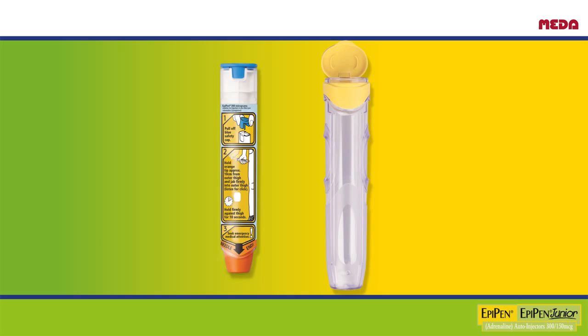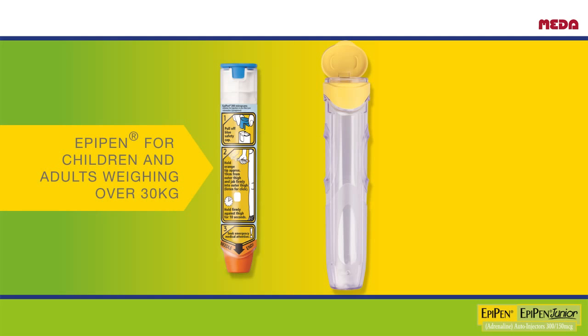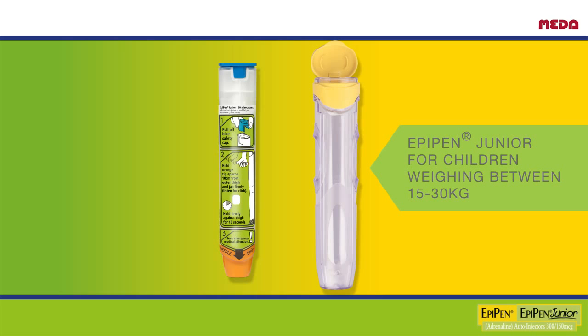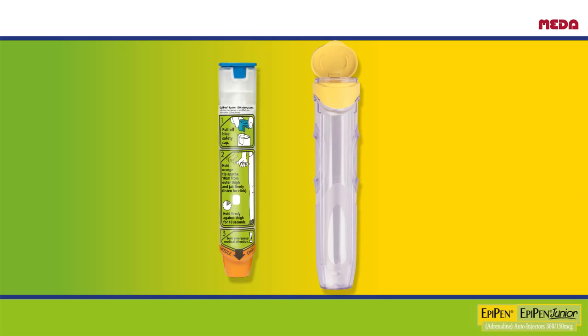This is the EpiPen Auto Injector. It comes in two strengths: EpiPen and EpiPen Junior. EpiPen is for patients weighing more than 30kg (4 stone 9 pounds) and has a yellow label. EpiPen Junior is for patients weighing between 15kg and 30kg (2 stone 5 pounds and 4 stone 9 pounds) and has a green label. Both EpiPen and EpiPen Junior work in the same way.